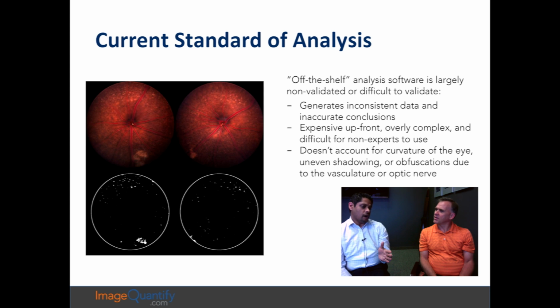And so when you're doing that, then you're adjusting that threshold every time you load a new image up, and that's obviously going to add some sort of bias to the situation. But the image that you see on the screen is generally what you're looking at. You're looking to see how many of the lesions are there. In most cases, people are just scoring them on a scale and saying this is bad or good or normal, and there's no real quantification going on. But this researcher did actually try that, and not with much success.